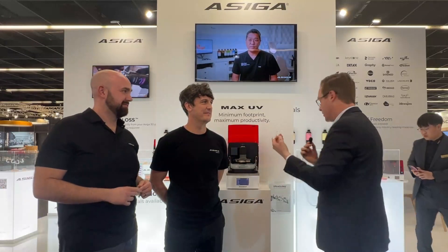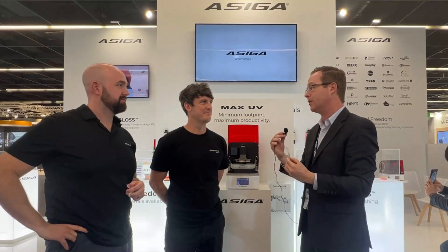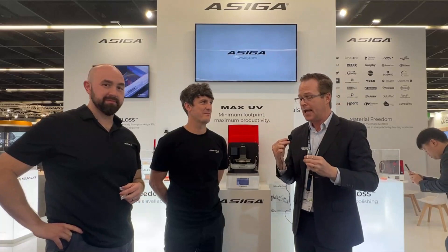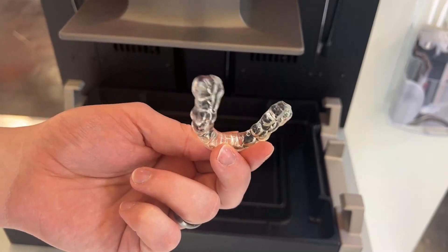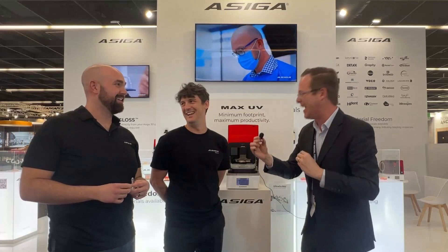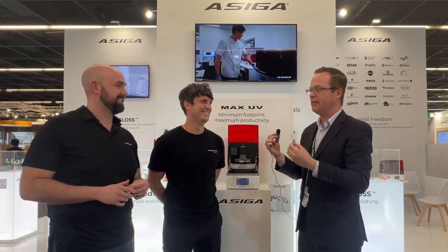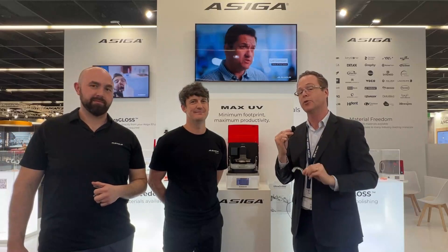Thank you both for telling me about this product and all the innovation happening here at IDS — thank you Graham and thank you Cory. There's something about occlusal guards that just drives us crazy, and this seems like something I'm ready to implement in my own practice. Early April — I won't quote you exactly on that, but thank you for everything. This is Dr. Michael Scheer from IDS Cologne talking about Ultra Gloss, the latest in 3D printing of occlusal guards. Thank you for tuning in.